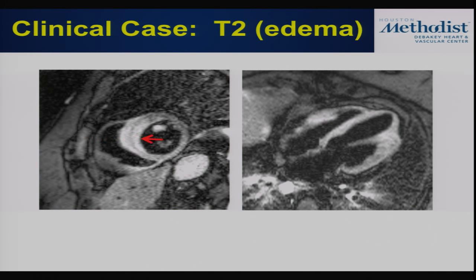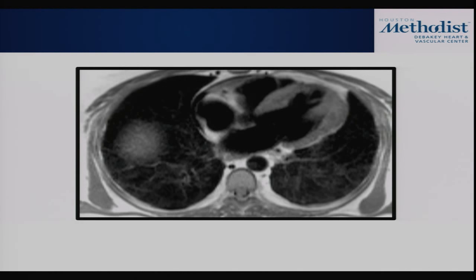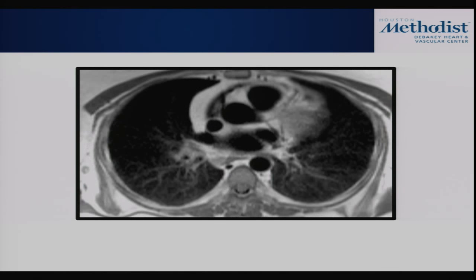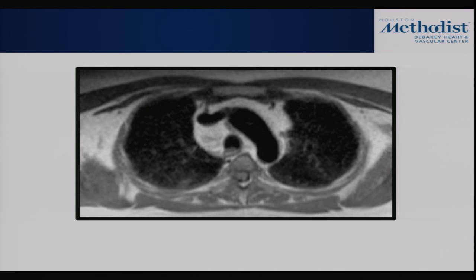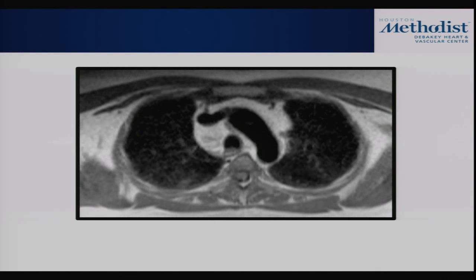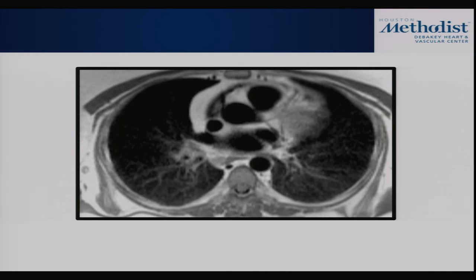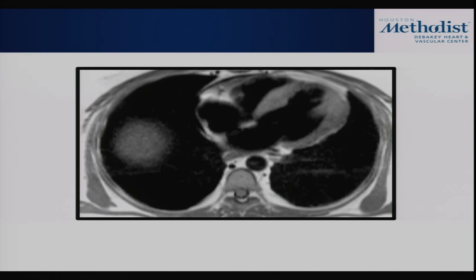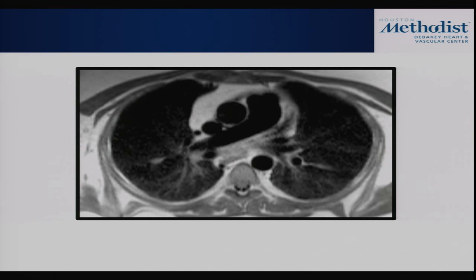And so obviously, you put this together, coupled with the next image, which I'm going to show you, which is just the simple morphologic images through the chest. And if you pay attention, I know we're not radiologists here, but pay attention to the parahilar and the paratracheal area. You see a lot of little nodules, right? Fullness. This actually is evidence of lymphadenopathy. And again, in every CMR scan, we'll always do some morphologic images through the chest as well to see if there's associated other abnormalities in the chest.